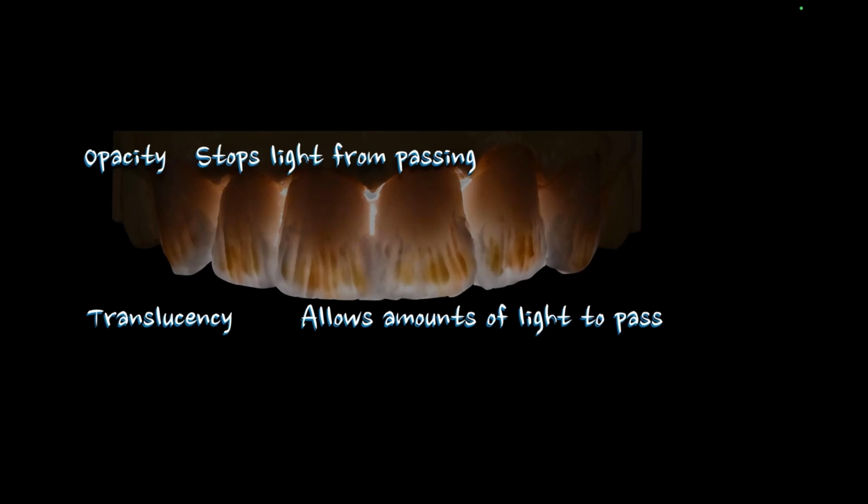So even your most translucent powder, most translucent monolithic material, all of them have some amounts of opacity in them. The number roughly is about 6% is the most translucent we can make a material. We can't make something that's pure glass, that's completely see-through, because even pure glass is not completely see-through. There are some opacified particles in it. So translucency and transparency are kind of two different things, although I think I'm using the word transparency later on, but I'm just kind of using it as a scale to compare how much more translucent we can be and what we want it to be.